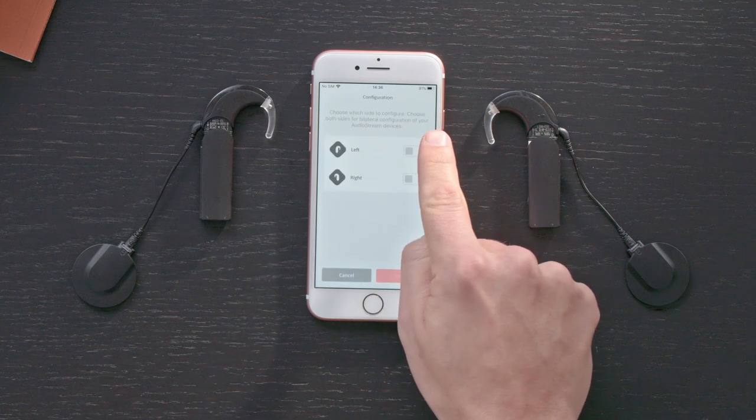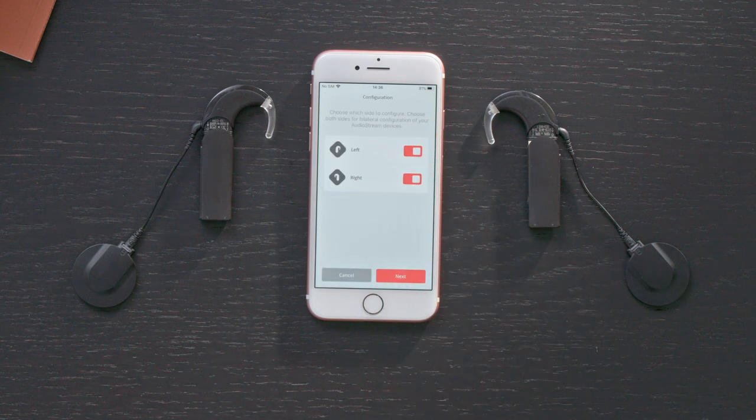If you have one AudioStream, select the side you wear it on. If you have an AudioStream on each side, select both left and right.